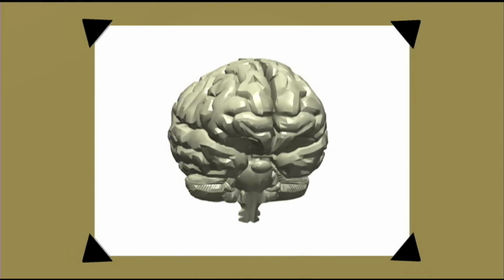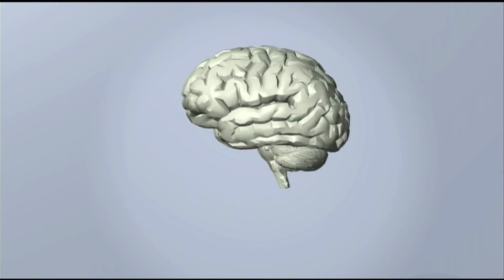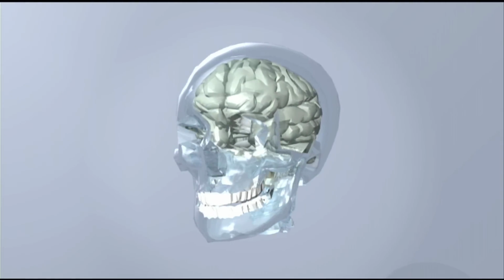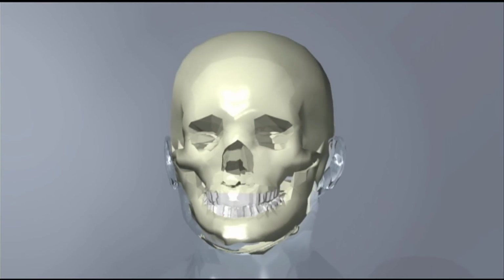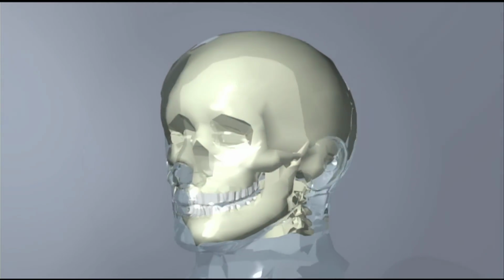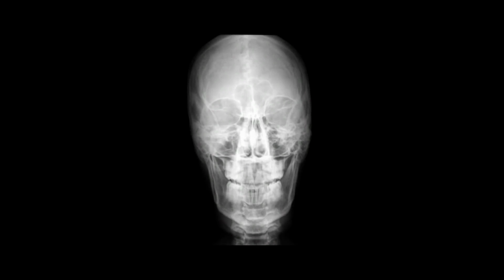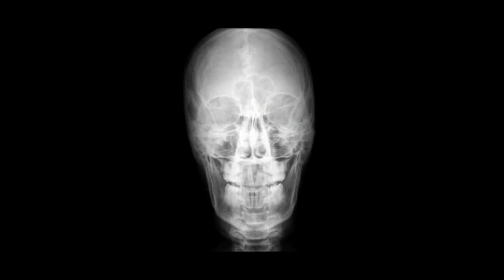The brain is encased in a thick skull that blocked a good portion of the X-ray light. Additionally, the brain floats in a fluid bath called cerebral spinal fluid, or CSF, that provides nutrients and acts as a cushion for the delicate brain matter itself. Because water and brain appear similar on a plain film image, the contents of the skull show up as a homogeneous shade of gray on a standard X-ray image of the skull.